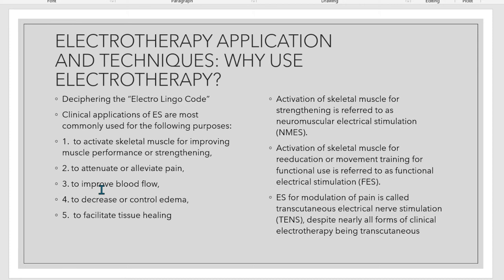Despite nearly all forms of clinical electrotherapy being transcutaneous. So, this is constant. One direction ang pag-fire niya. So, monophasic. Isa lang ang direction. It could be modulated pulse or it could be interrupted. Basta monophasic lang siya. So, basically for pain.